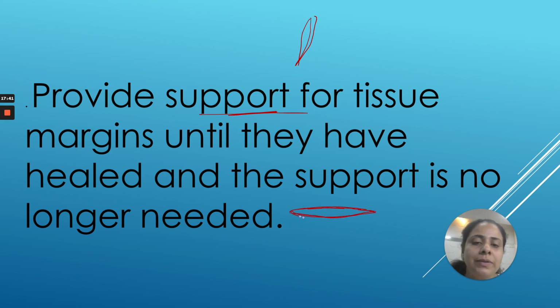So what happens when the healing starts? There will be new tissue formations around these flap margins. So what I want is to approximate these flaps so that they have healed, and then only I will remove the sutures. They support my tissues. Okay, so they give a lot of support to my tissues, and once they no longer need the support, I can remove them. This kind of suture material, this kind of suturing I want to do.